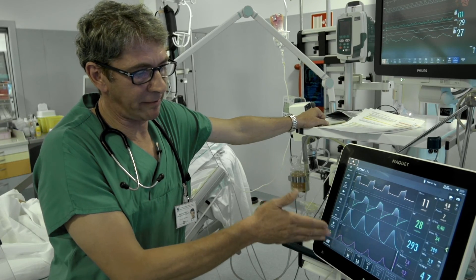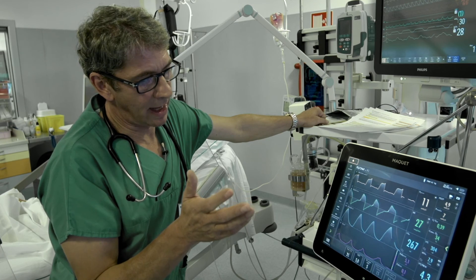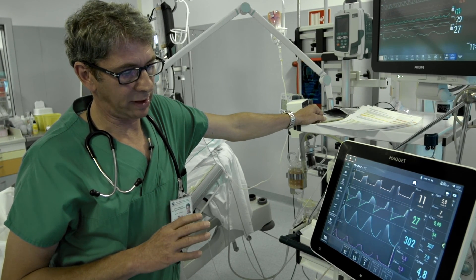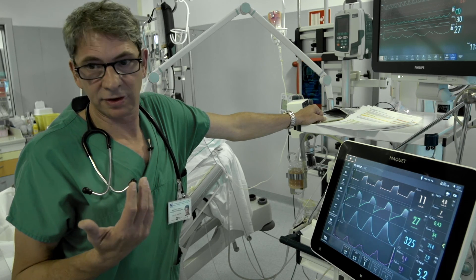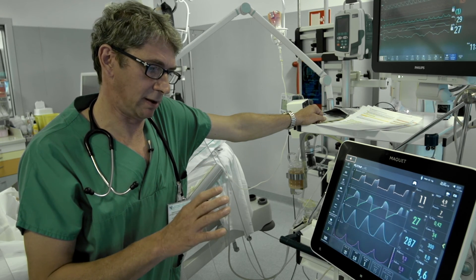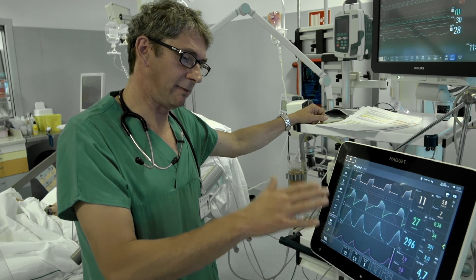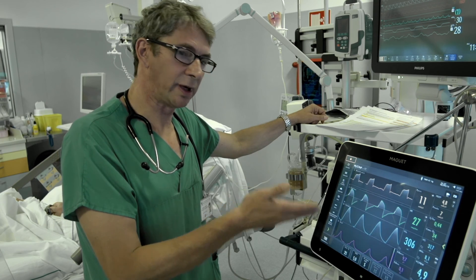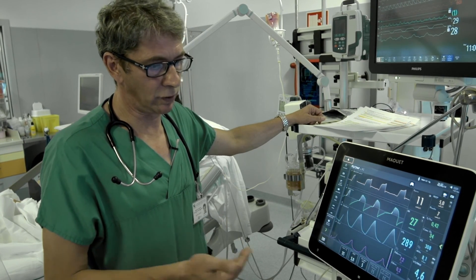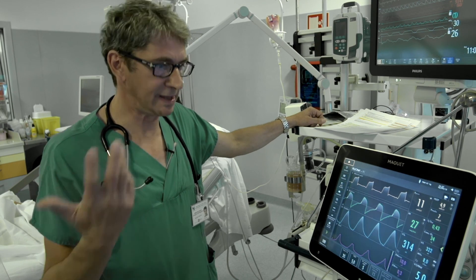At the moment, we have good diaphragmatic activity. The tidal volume is still a little lower, but we will check the blood gas analysis. If the patient does not increase the EDI peak too much, I think this is a good ventilation setting. If the EDI peak is stable, I can say the patient is properly working with the diaphragm — and the patient has lost almost 10 centimeters water of pressure support, meaning the patient was really over-assisted before, even though respiratory rate and tidal volume suggested the level of assistance was adequate.